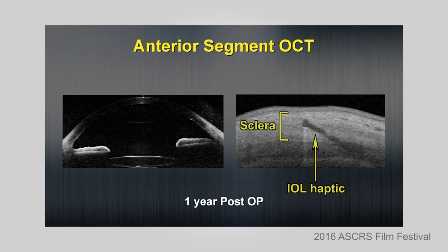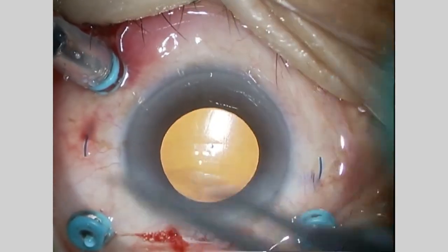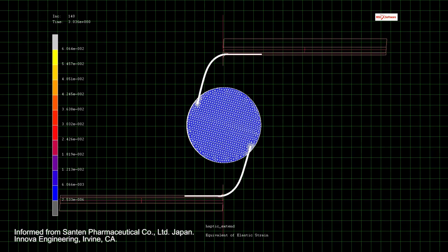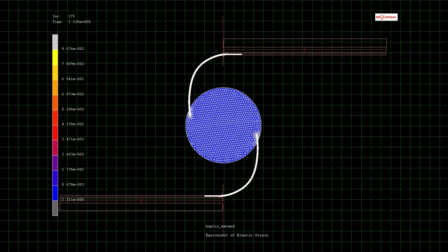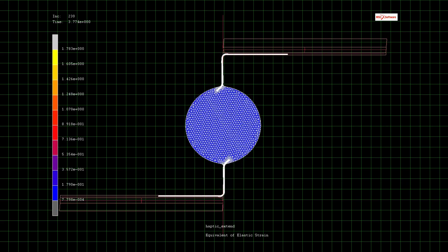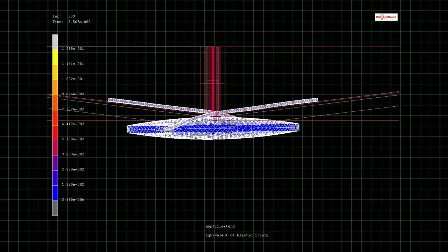Is there any way to adjust the position of the IOL and fix it at target refractive values with absolute accuracy? On the simulation, the IOL's optic part shifted 0.4 millimeters upwards. This means that if a 20-diopter IOL was used, it would change by approximately 0.4 diopters.